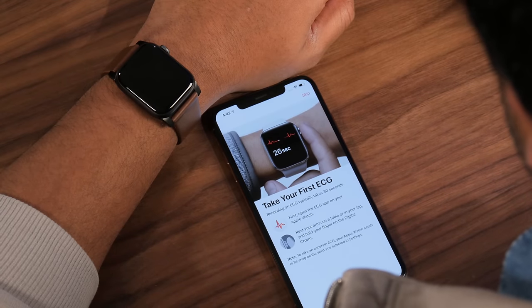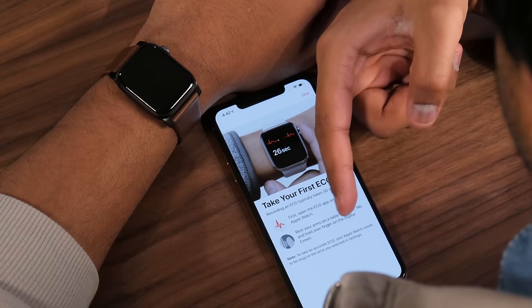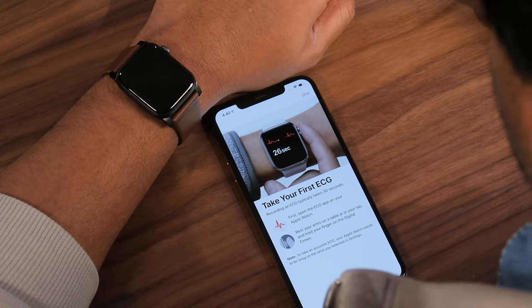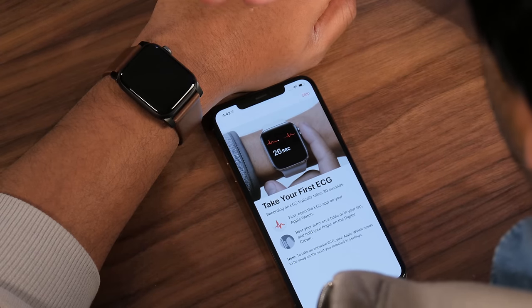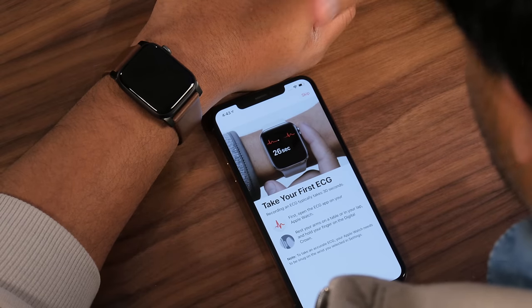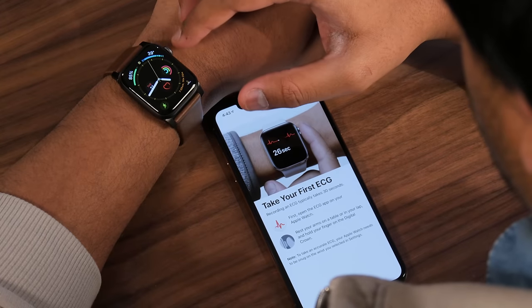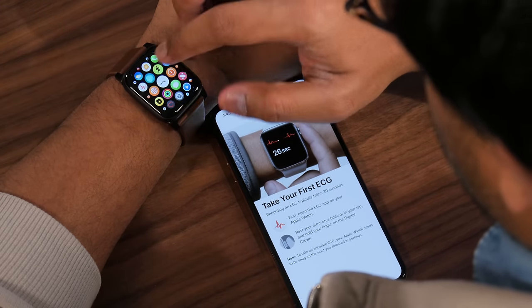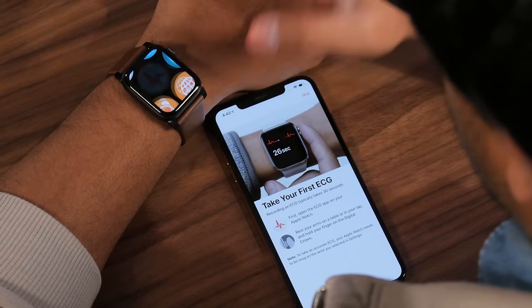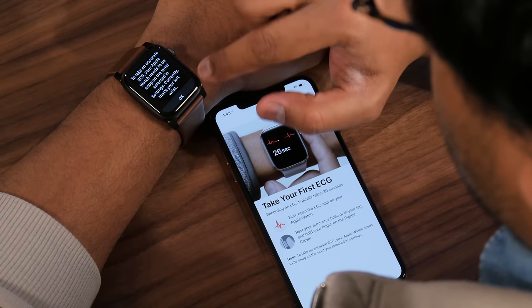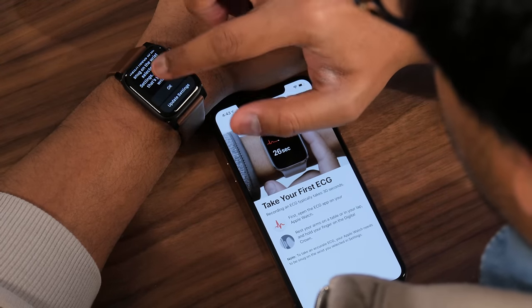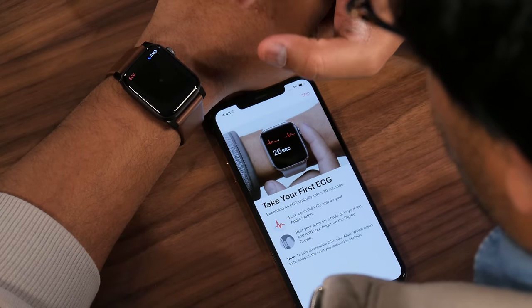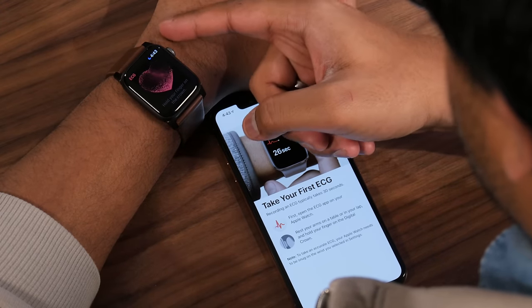To take your first ECG, note that your Apple Watch needs to be snug on the wrist you selected in settings — make sure it's on the wrist you configured when you first set up the watch. Open the ECG app on the Apple Watch by tapping the crown and looking for the ECG app, which looks like a heartbeat icon. The app will confirm which wrist you configured. Tap OK, rest your arms on the table, and hold your finger on the digital crown.